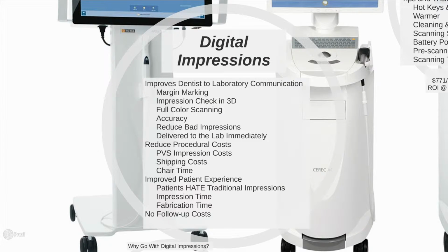It also allows the doctor to check the impression in a full color 3D scan that they're able to rotate and check to make sure that they have all the required information to produce the desired restoration.